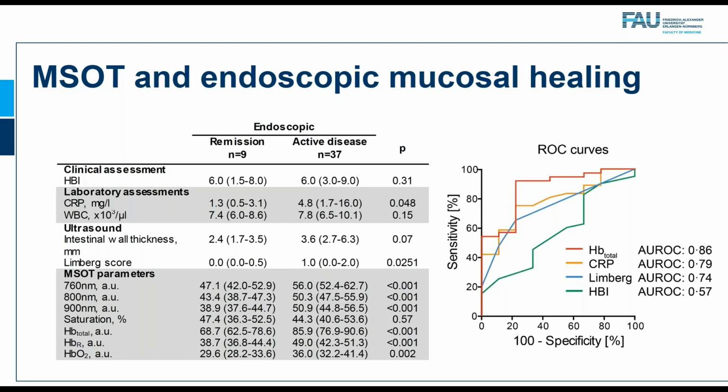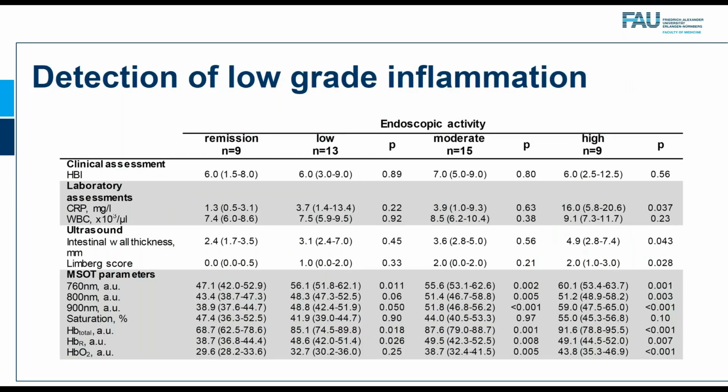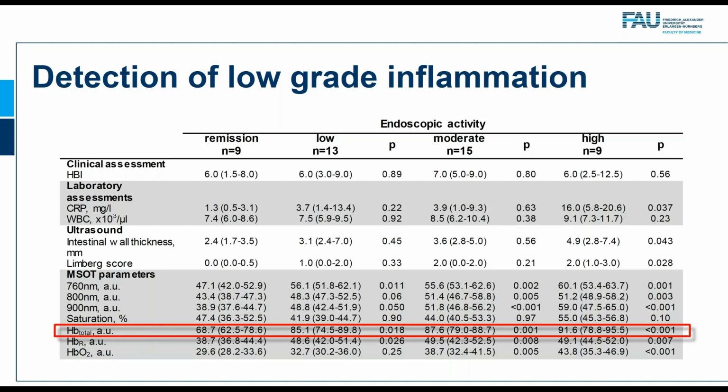When we then also compared the grade of disease activity, optoacoustic imaging was among the only techniques or measurements that we made that was even able to discriminate between patients with remission and low-grade activity, which is something that's extremely important also in the context of treatment monitoring.